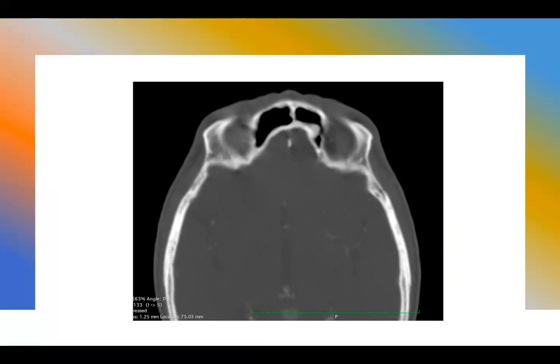Bone metastasis was actually considered, and immunotherapy was about to be ceased. But we performed a CT scan and that highly pathognomonic lesion was found: an osteoma in the left frontal sinus, which was actually stable when we retrospectively saw some scans from 2 years before. So that was an innocent osteoma and the patient continued the immunotherapy.